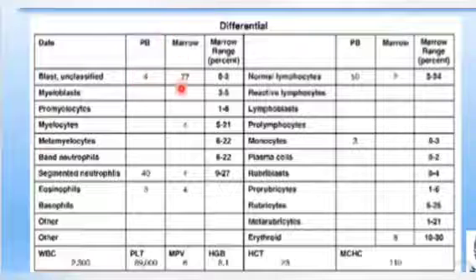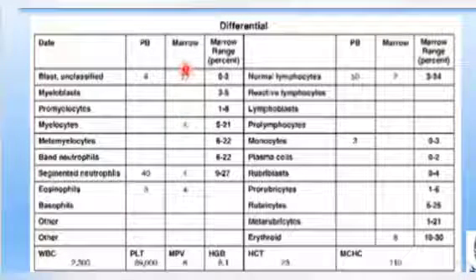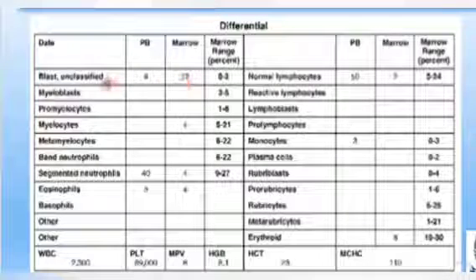Then you are going to require the bone marrow aspirate or bone marrow trephine biopsy. So here this is a bone marrow aspirate, and you are looking for the hemogram and myelogram as well, like blasts are 77%. It means that blasts are very high, and if you have more than 30% blasts in a bone marrow or peripheral blood, then you think about leukemias.